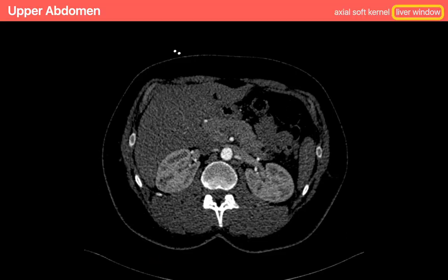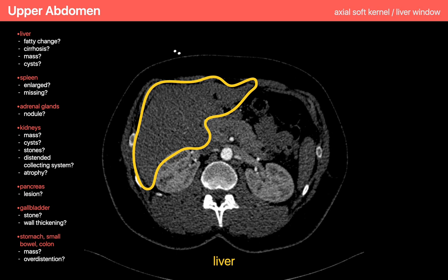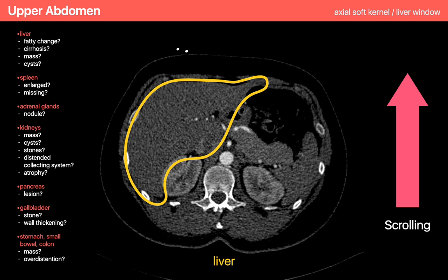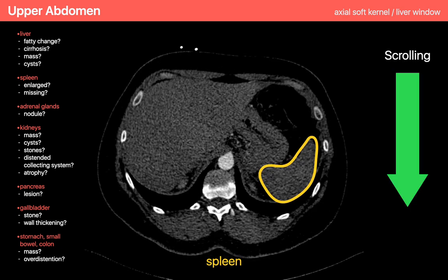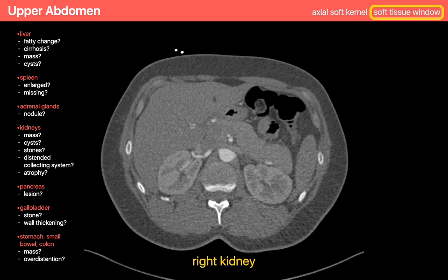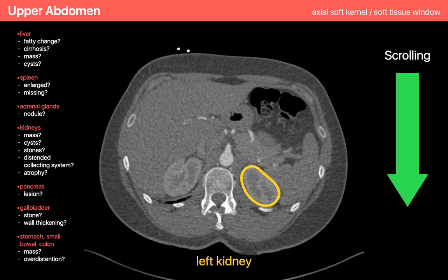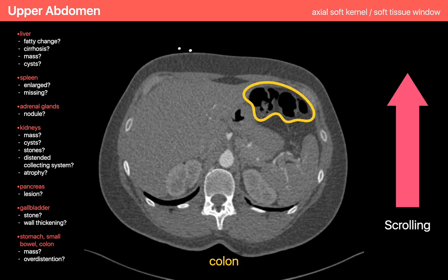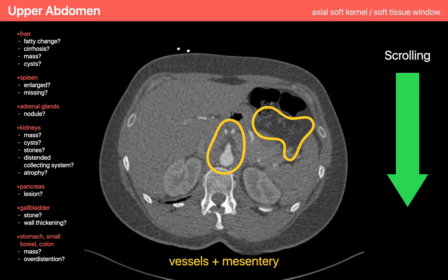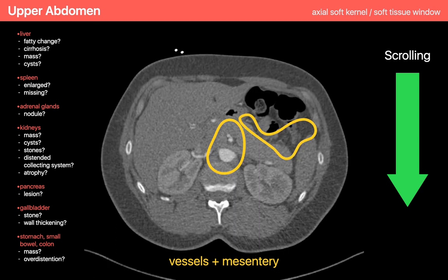Now I review the upper abdomen, beginning with a liver window and inspecting the liver for steatosis. I'm looking for liver parenchymal attenuation at least 10 Hounsfield units less than the spleen, or an absolute attenuation value under 40 Hounsfield units. I'm paying attention for nodular liver contours indicative of cirrhosis, or any cysts or masses in the liver. I look to see if the spleen is enlarged or missing, or if there are any abnormal lesions within it. Then I jump to a normal soft tissue window to review the kidneys, adrenal glands, pancreas, stomach, colon, mesenteric fat, and whatever vascular structures I can make out on these limited images of the upper abdomen.